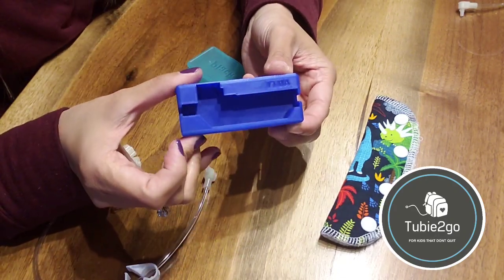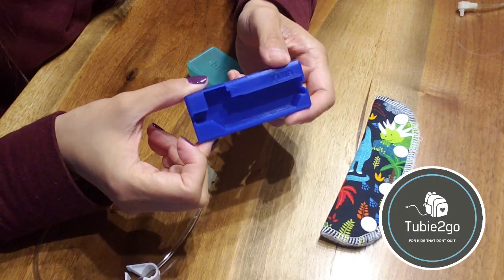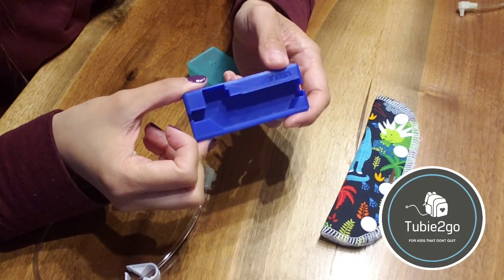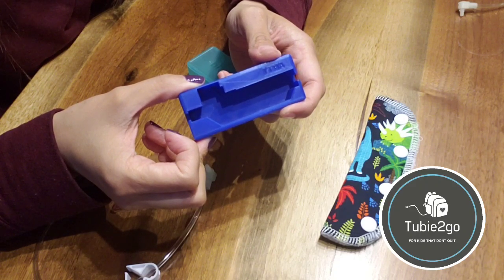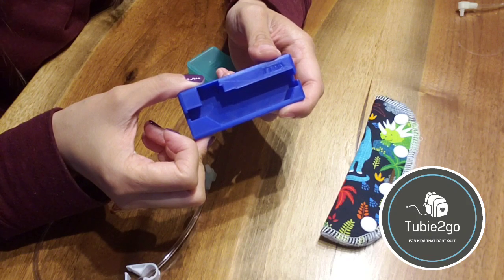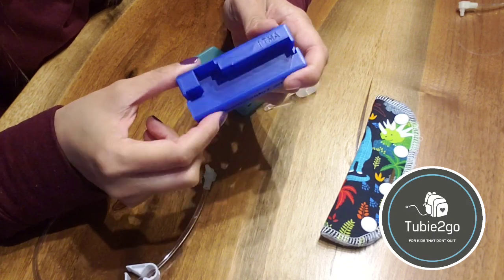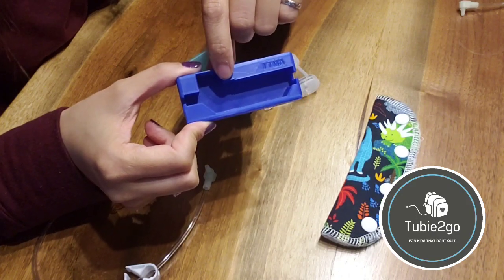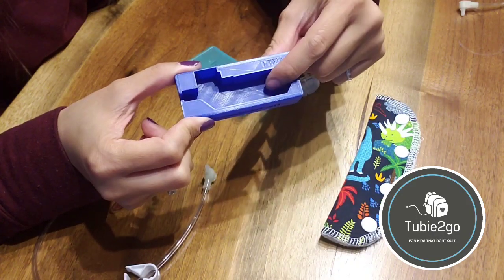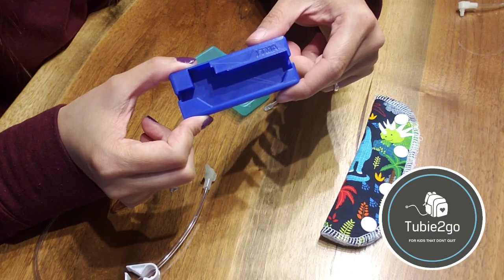There is a Tubieguard, which is a great solution, lightweight plastic. It's a patent pending solution, but it is not universal. It is only available right now for certain combinations of Infinity and Kangaroo feed bags to go with the Mini and Mickey extension sets. But it is a great solution if that's what you are using. It will make sure that the med port stays closed, as well as the two ports on your feed bag and your feed extension stay secured together.